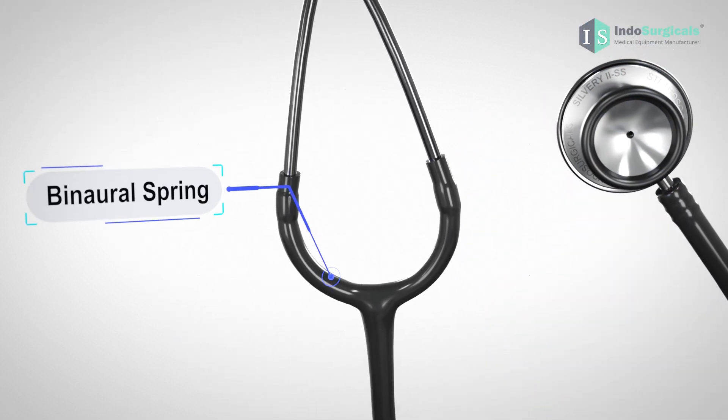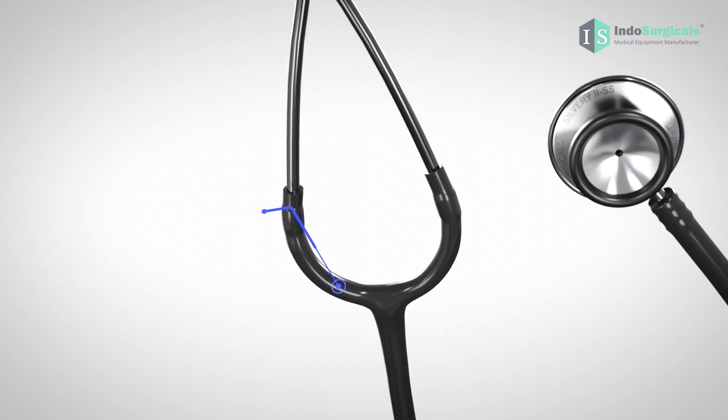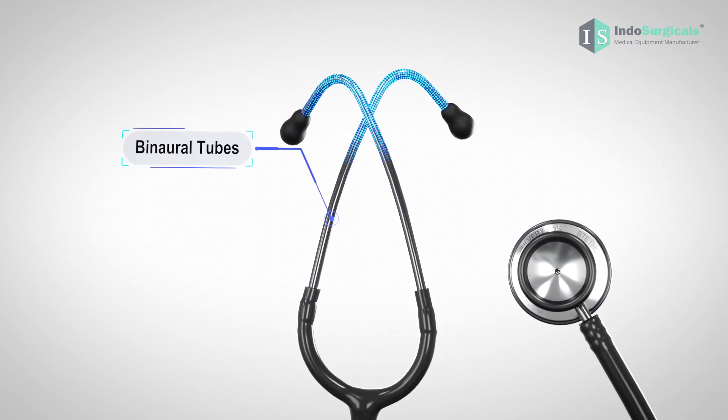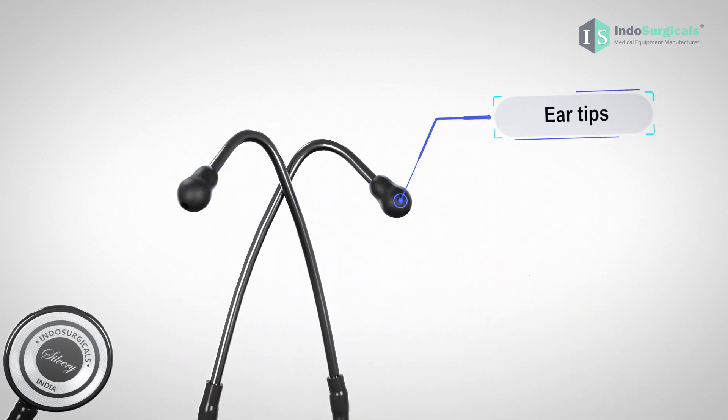Inside the U-shaped PVC tube, you'll find the binaural spring, which ensures a snug fit. These are the binaural tubes, and at the end of the binaural tubes are the ear tips that go into your ears.